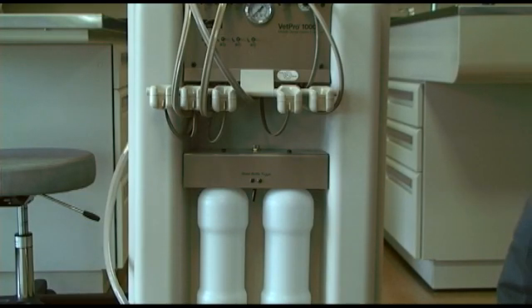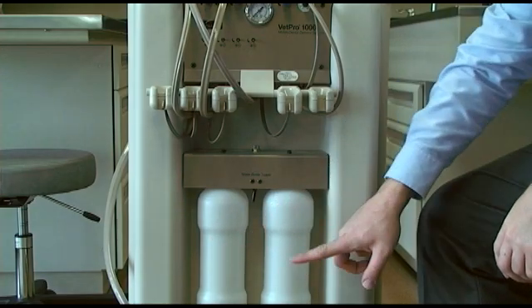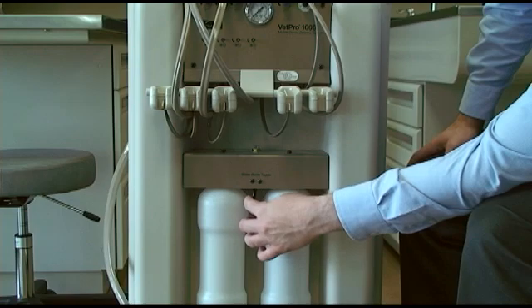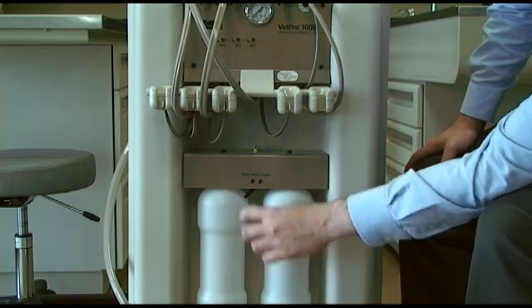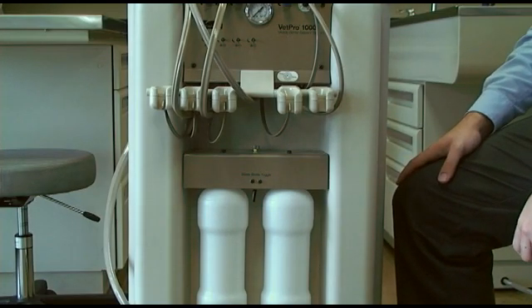Below the handpieces, you will see the water bottles and the toggle switch that allows water to come from a specific bottle. You should only use distilled water in these bottles. The toggle points to the bottle that is pressurized for use. When the toggle is in the center position, neither water bottle is pressurized.